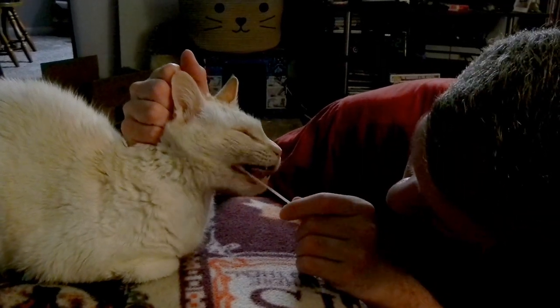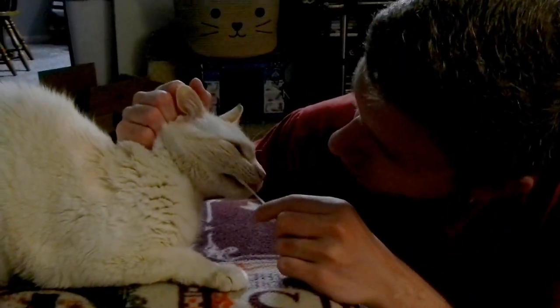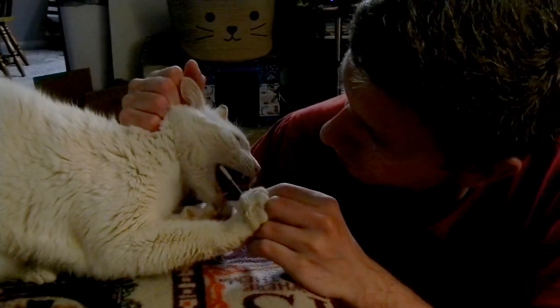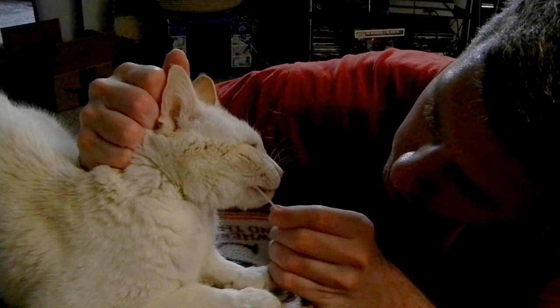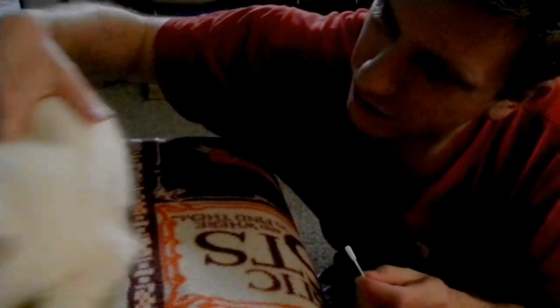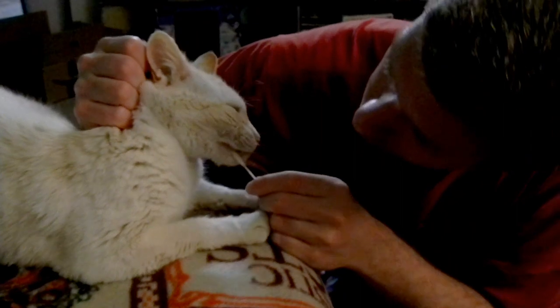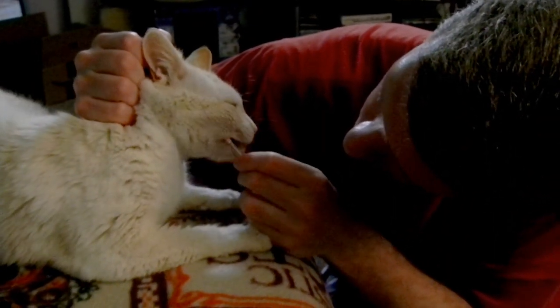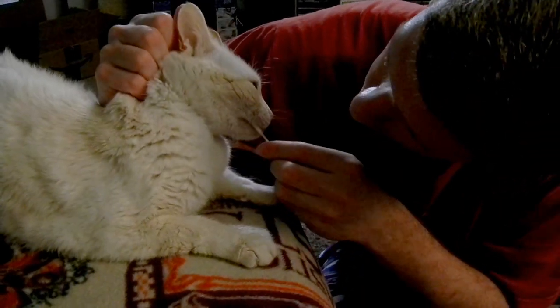Fifteen seconds? Yep. One... oh, stop. Sorry. I know you're old, girl. One, two, three... sorry. Sorry, baby. Ragdoll, right? Four, five, six, seven... I'm sure there are better ways to do this. Eight, nine, ten... I think I missed. Eight, nine, ten, twelve, thirteen. Almost done. You're a good girl. Thirteen, fourteen, fifteen. I gotta let it air dry for five minutes. But we could do the other one off camera since she doesn't like that.